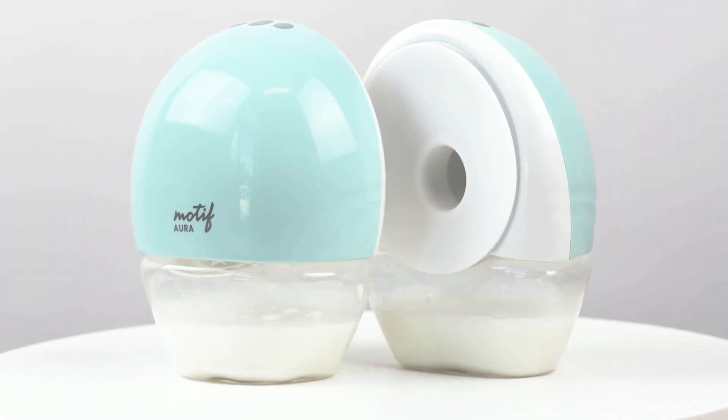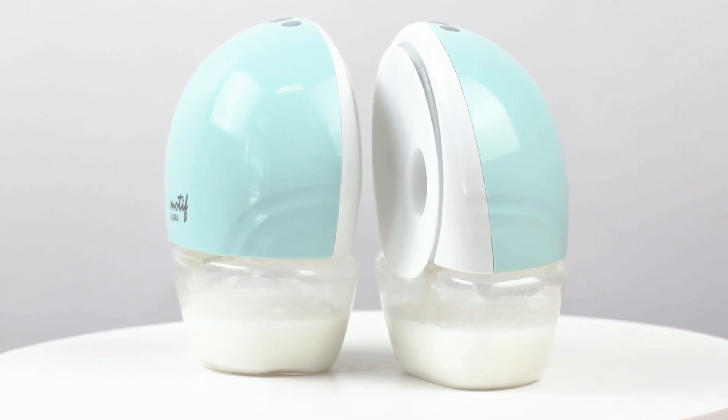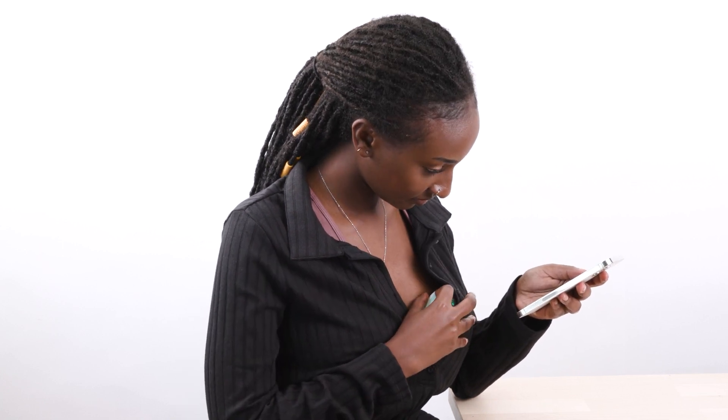The Motif Aura wearable pump can be operated with or without a phone. In this video, we'll walk you through how to control your pumping sessions from your phone with the app.